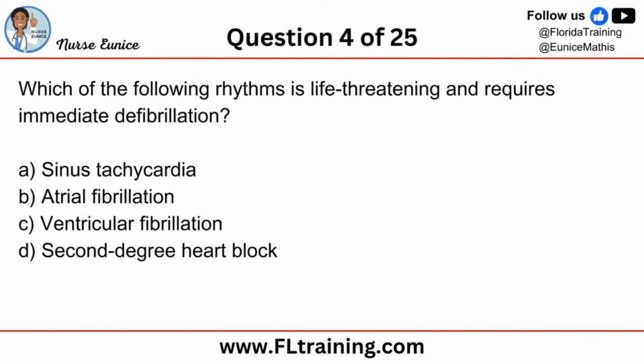Which requires immediate defibrillation? Looks like Merlan says D. Alabari says C, Miriam D, Elise B, and so Mila says C, Love says C. So we have a lot of correct responses.